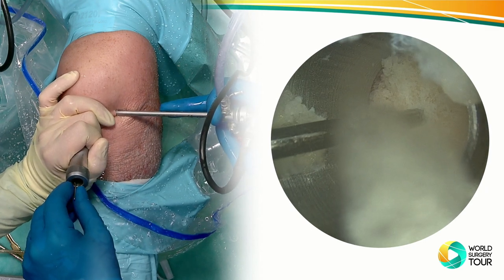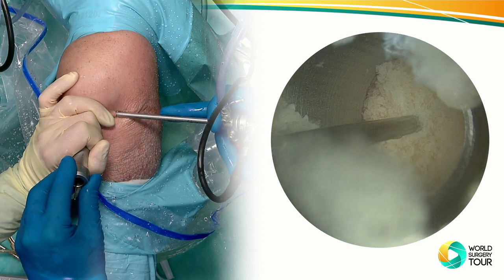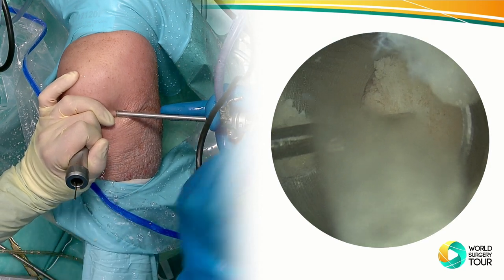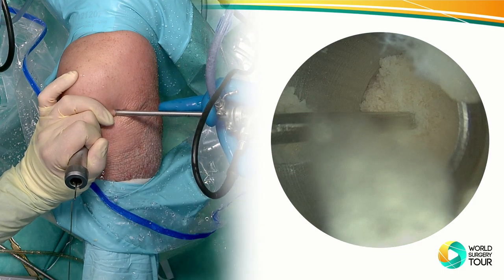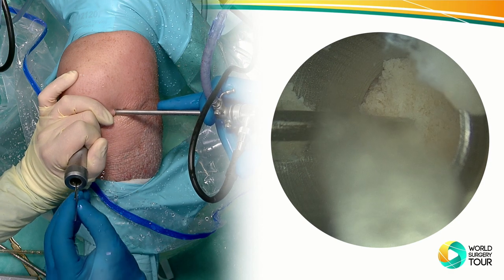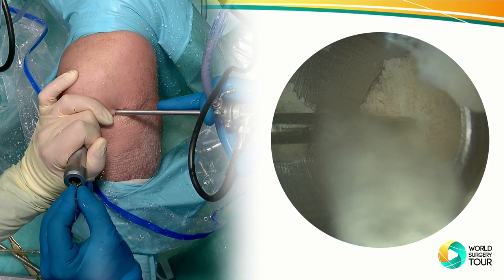And now what you could do, if you have a larger defect, there's a second wire that can be inserted. That has on the side of the cannula an option. And just bang it in with a mallet, or?